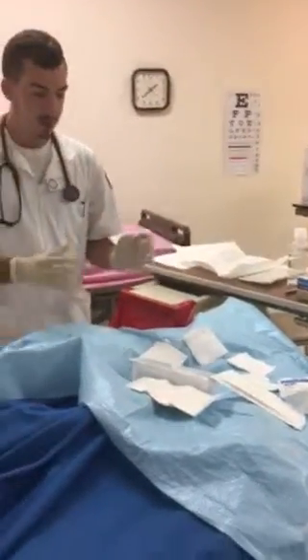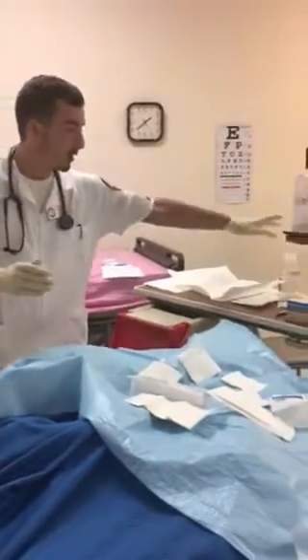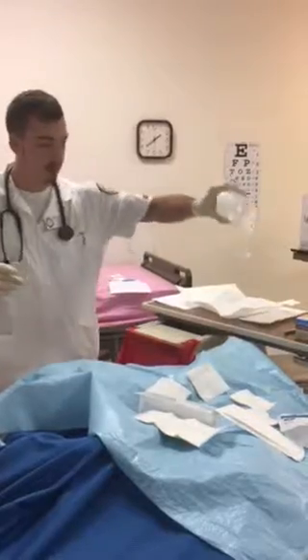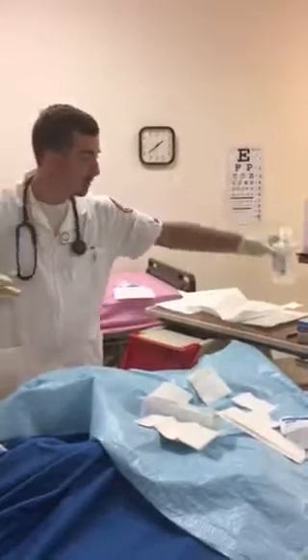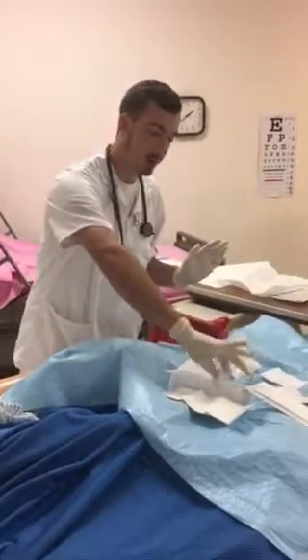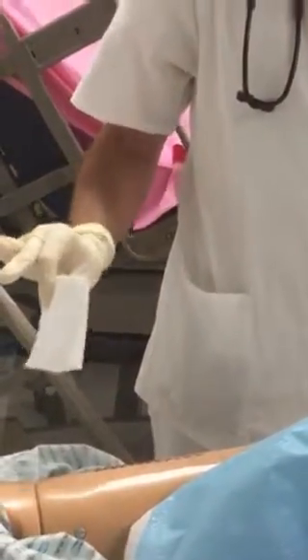And now I'll be ready to break sterility on my non-dominant hand, and I'll open my saline and go ahead and pour it into the container with the gauze, making sure not to compromise my sterile field. With my sterile hand, now I'll go ahead and clean the incisional wound, and I'm going to clean from inside to out, from clean to dirty.